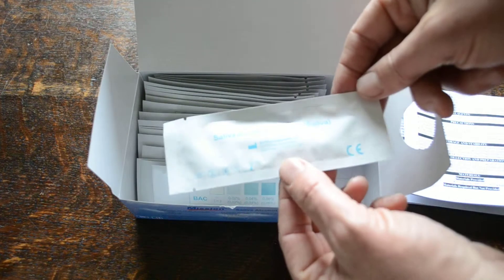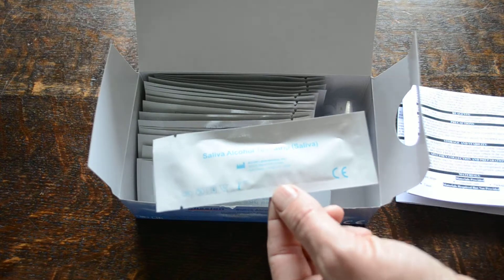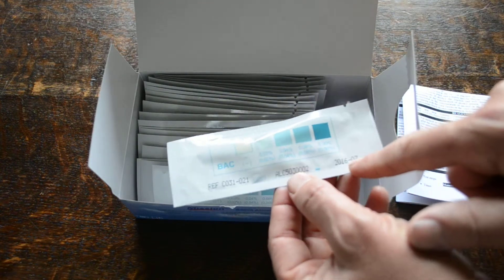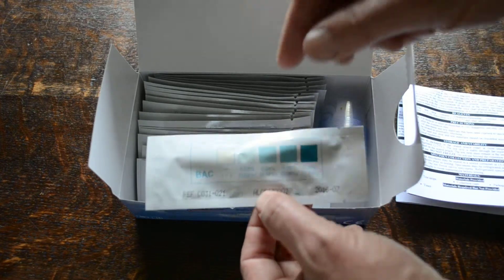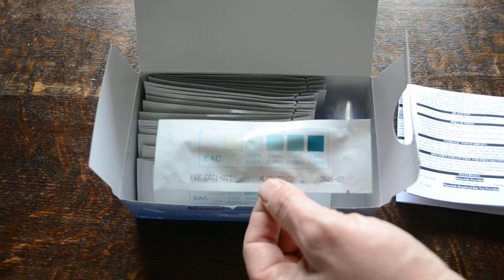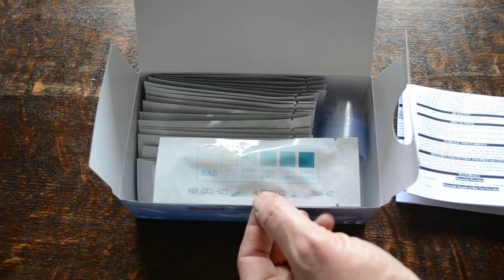These are individually foil-wrapped saliva alcohol test strips manufactured by Akon Laboratories. The expiry date is clearly shown on the back — this is 7/2016, with the ALK reference and catalog reference. When you open these, you've got a foil pad on a strip which reacts with saliva and gives you a semi-quantitative result.